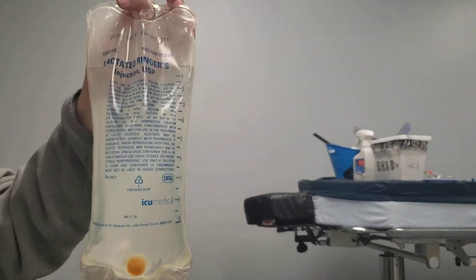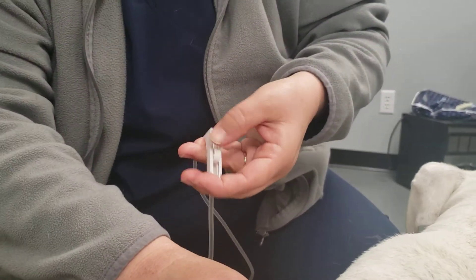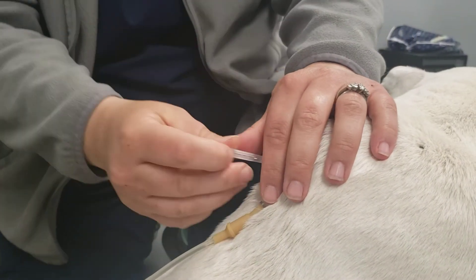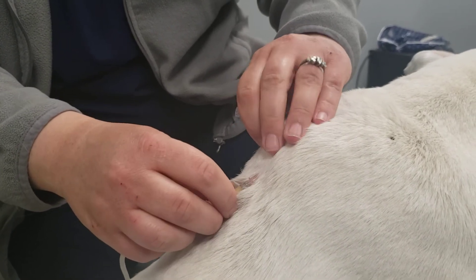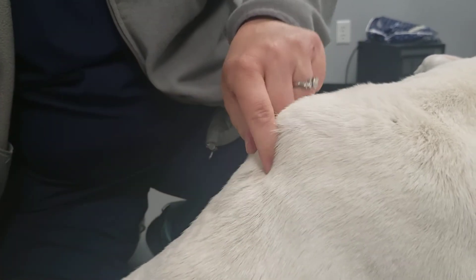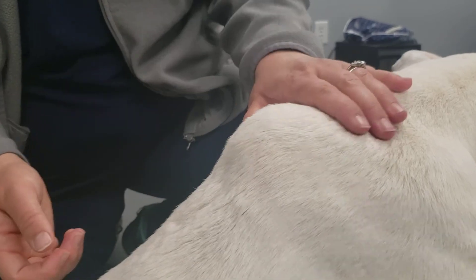Once the fluids are finished, you can put the bag down and roll your little roller down. A paper towel or a piece of gauze will help hold that off for a minute. Then you'll pull the needle out, put your needle cap back on, and hold that off — because sometimes a few drops of fluid will leak out, and that's okay.